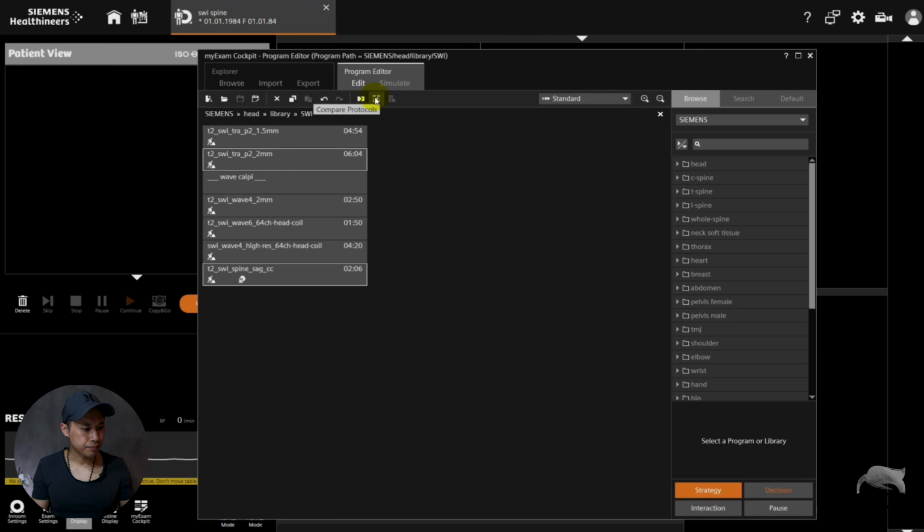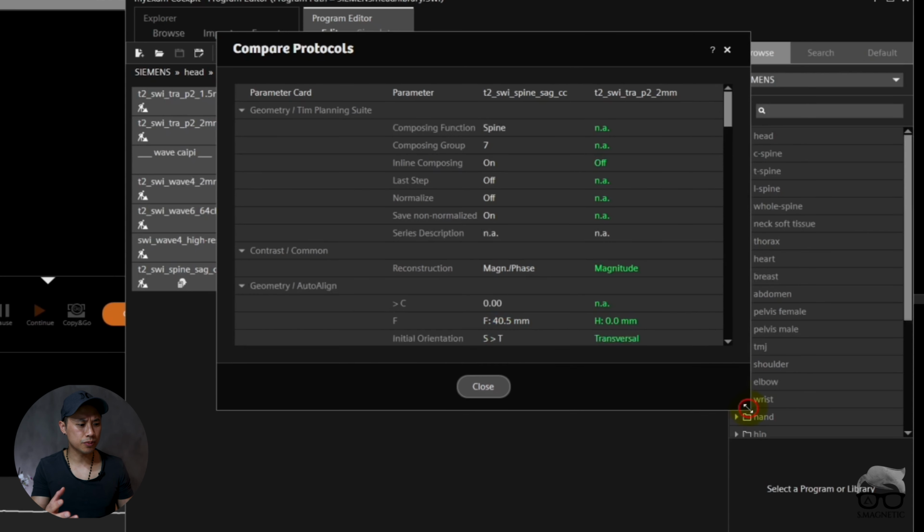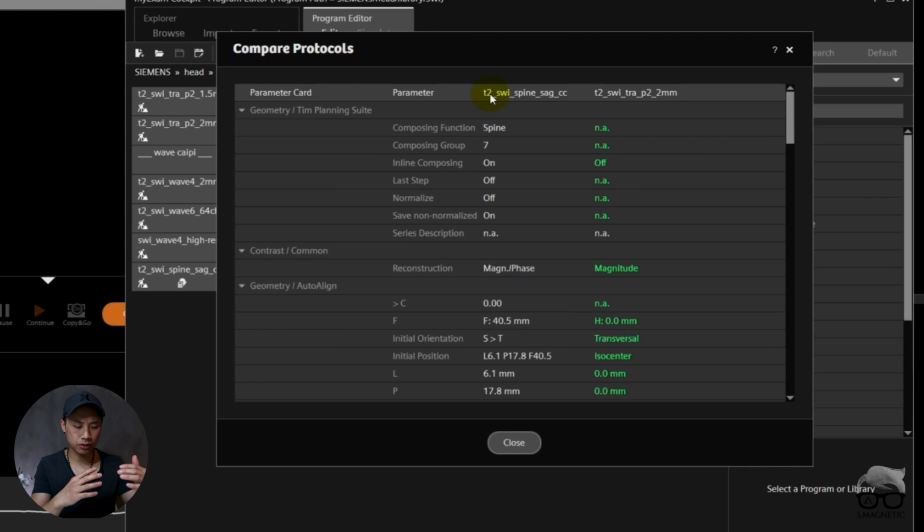Let's go in here. So you can see here on this side is the one I optimized. On the other side right here, it's the one from Siemens tree. You can see what differences I made, adjustments compared to each other. I'm just going to walk through fast here for you, but however, you can pause the video and do exactly what I did here if you want to rebuild the protocol.